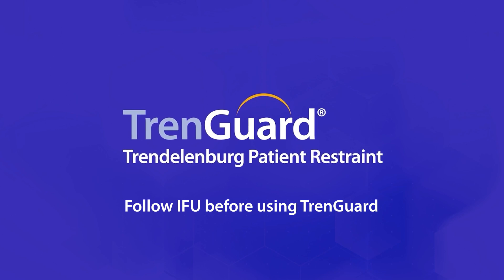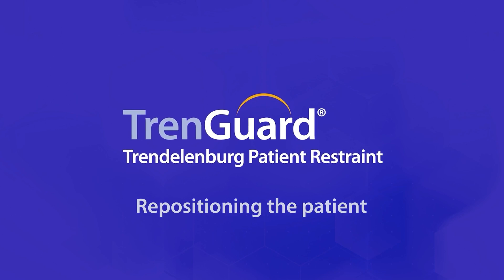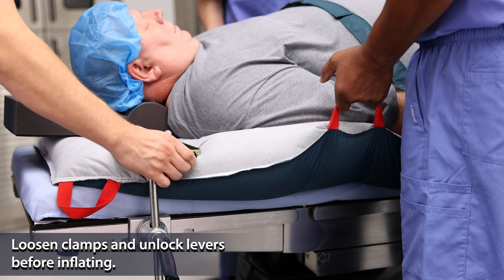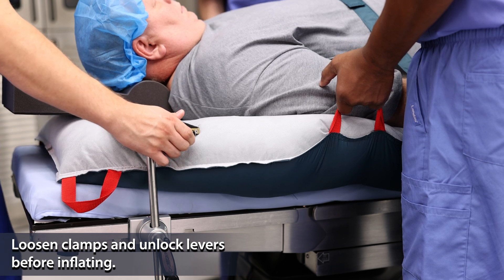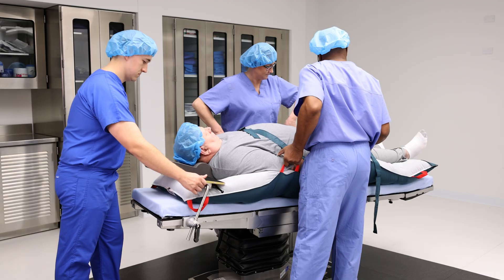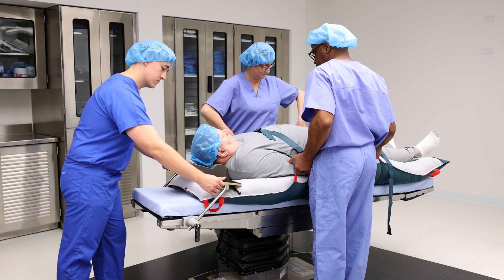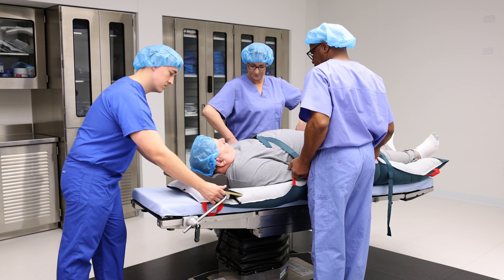Always read and understand instructions for use before using TrendGuard. The TrendGuard dynamic frame makes repositioning easier when patients are on a wide range of underbody devices. Here's how it works with air assisted transfer: the TrendGuard frame should be on top of the underbody device. Loosen clamps and unlock black levers before inflating the device. The dynamic frame moves freely and glides along effortlessly with the patient during repositioning.